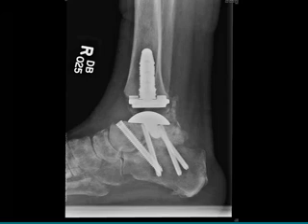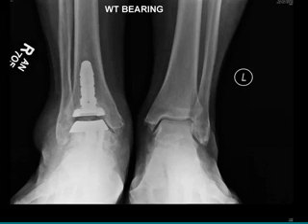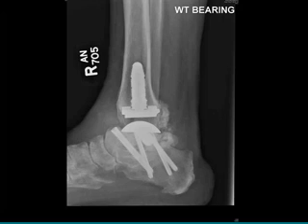And two, if you're going to do a subtalar arthrodesis now, and I've changed, I don't think we should ever bring the hardware from the front. I think that adds additional jeopardy to the blood supply to the talus. And so now I'm putting in the screws across the subtalar joint from the posterior tuberosity to the calcaneus and coming up more vertically and trying to avoid the artery of the sinus tarsi and preserve the blood supply to the talus. Well, this is what she looked like after surgery, and so both she and I were pleased.